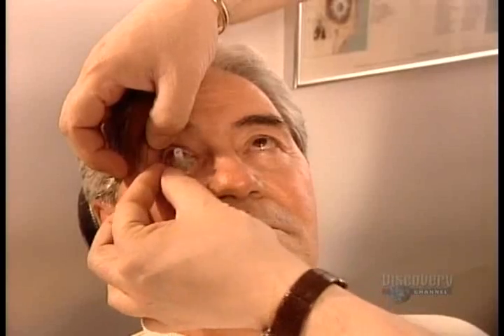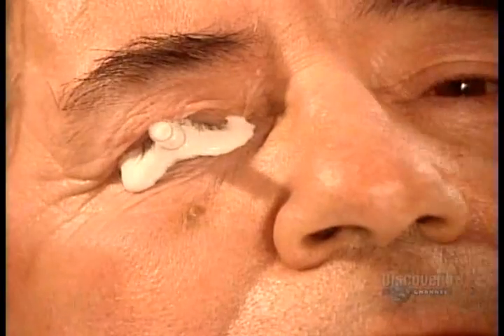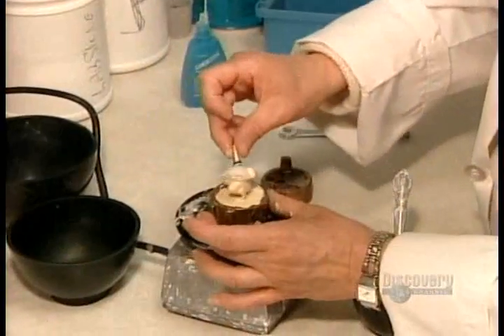No two people's eye sockets are the same, so the first step is to take an impression. After inserting the impression tray, they inject a material called alginate, filling the entire socket cavity. After 90 seconds, the alginate sets and they can remove the hardened impression.